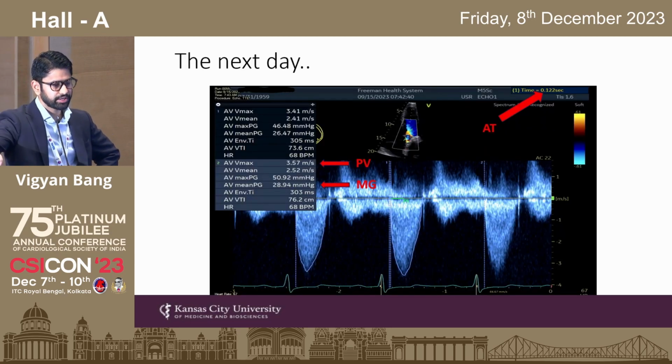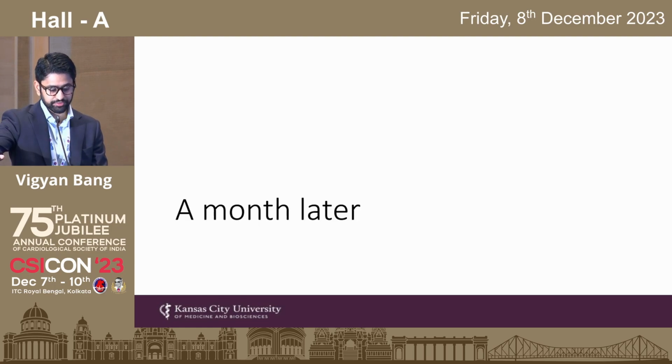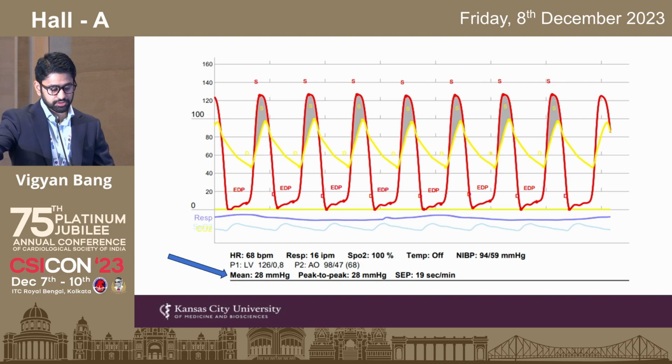And I felt that given how calcified the leaflets were, given how difficult it was to cross the valve, this was most likely related to some degree of recoil of the valve frame. And given that this was a self-expanding platform, we gave him some time to see if it would improve over time. And there was no change on his repeat echo in a month. So we brought him back to optimize his valve performance.